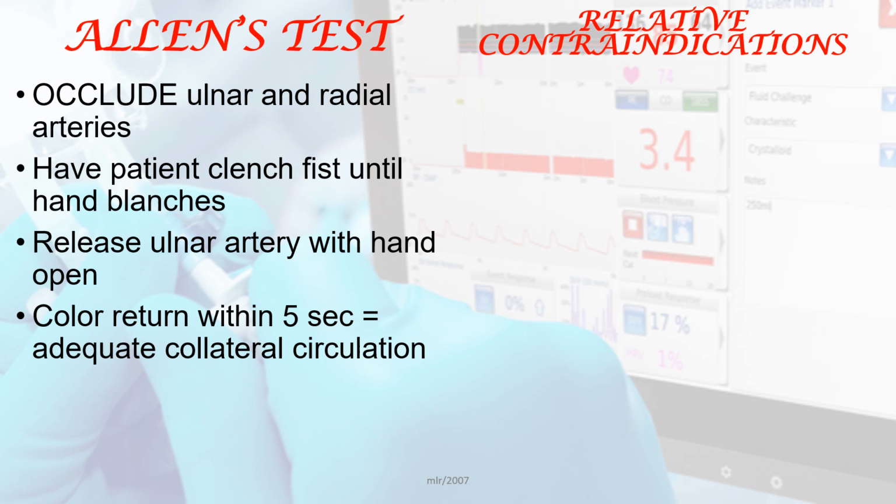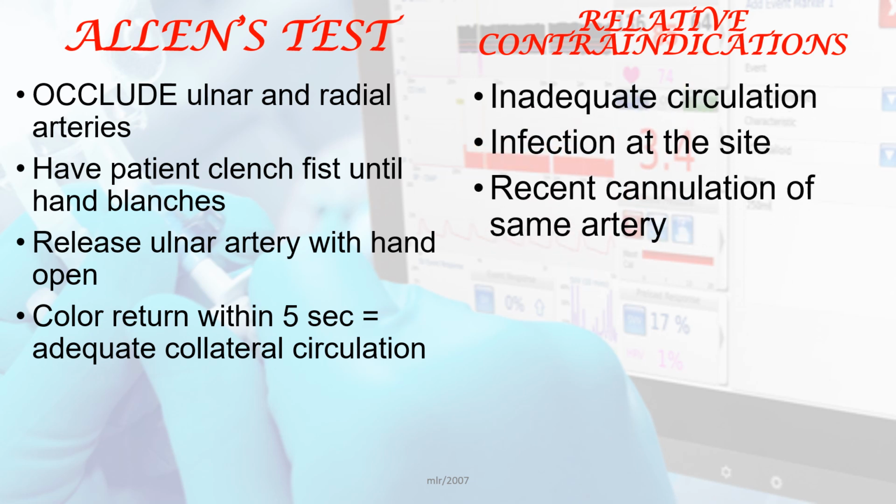Then, what are the contraindications? If there is inadequate circulation, infection at the site, or recent cannulation of the same artery, it is contraindicated to insert the intra-arterial line at that particular site.